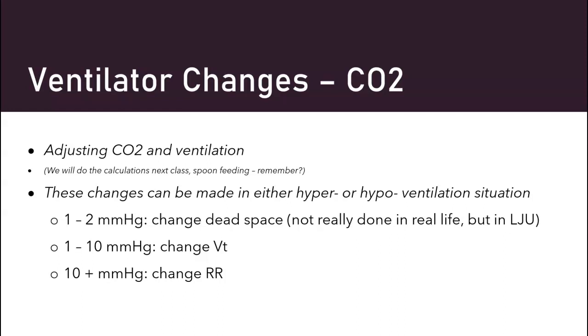An analogy I like to use is big bites and little bites when it comes to changing CO2. If I have a blood gas and I need to make large changes, I like to call them big bites. But if I am just fine-tuning or making smaller changes, I call them little bites or little nibbles. I like to think of my tidal volume as being for my smaller changes. They're my little bites or little nibbles changes to my blood gas. Think of it as that.